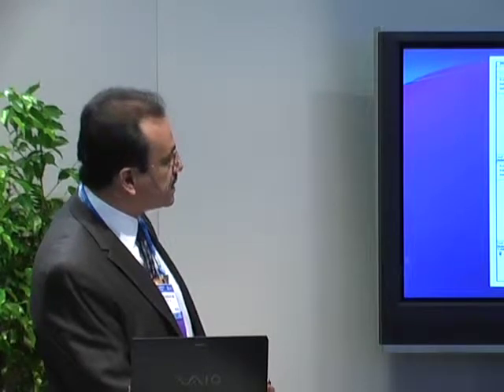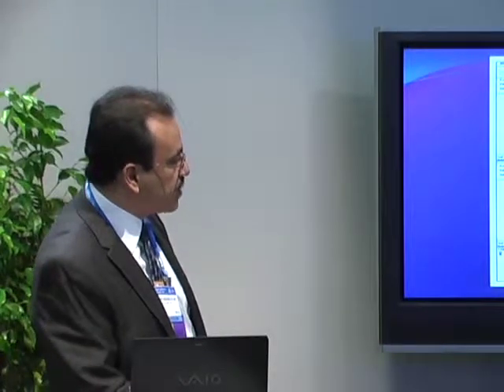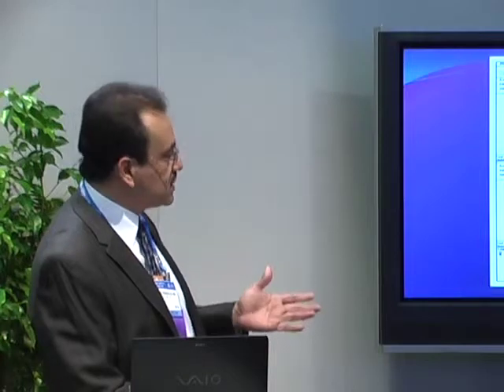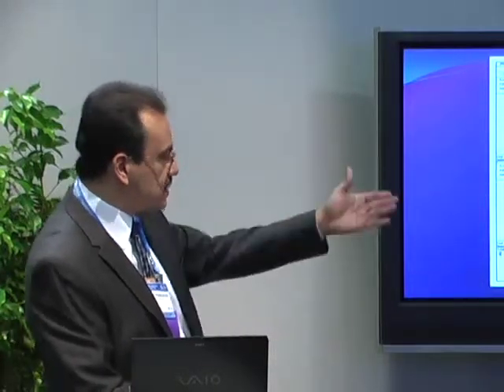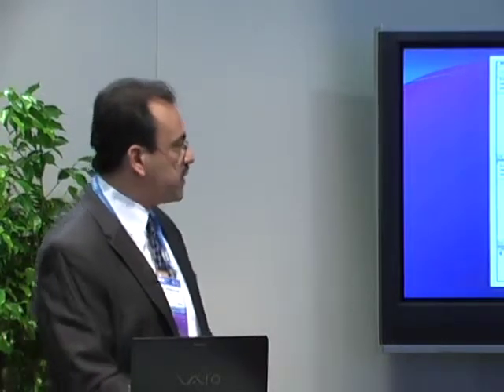Normal in this eye, so obviously it correlates with what we see. We don't see anything going on with that right eye, but the left eye, as you can see, she's had a very significant drop in macular sensitivity here. Now, she's been worked up. She's being treated on steroids, and actually she's coming in next week, and we'll have a way for us to begin to see if our therapy and our intervention is functioning.